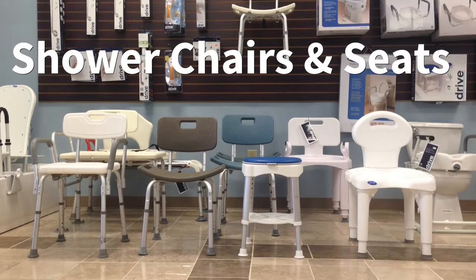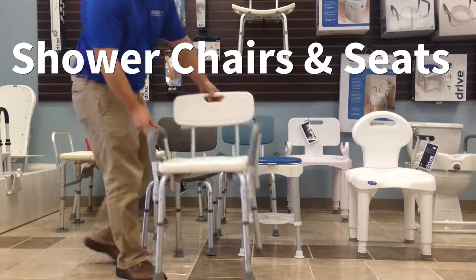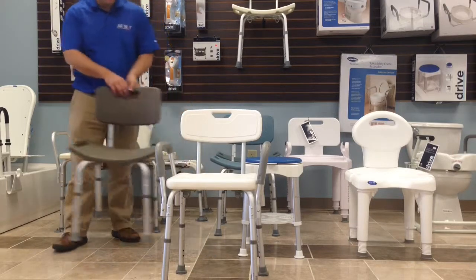Today at All Star Medical we want to show you our wide variety of shower chairs and seats. The first one we want to show you is a shower chair with arms. It makes it easy for getting up because you have arms to push off of.